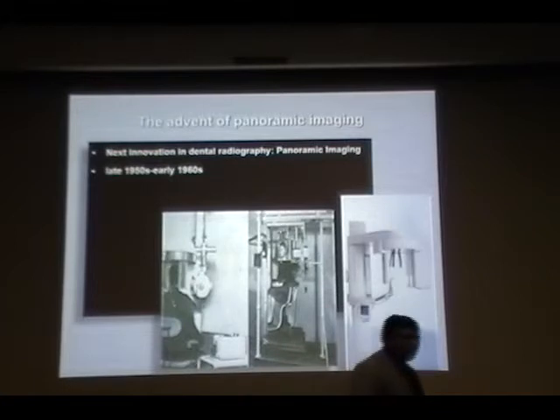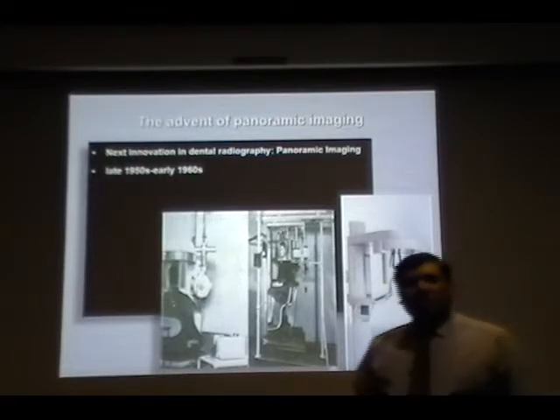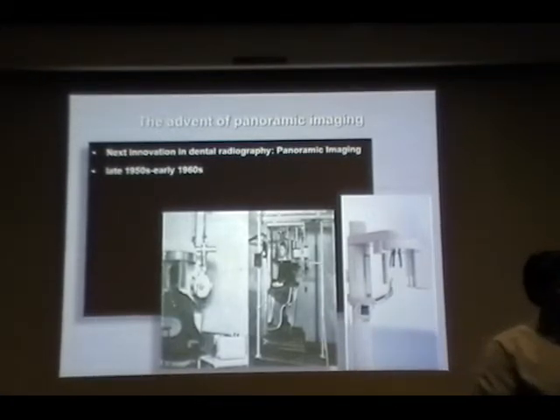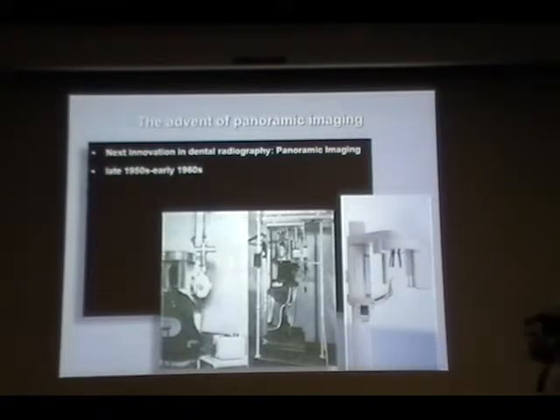So it's better to use the term panoramic radiograph, or if you find that too long, you can call it PAN, P-A-N, or PANO. And if you talk to older clinicians, they say, hey, go and get the Panorex, because they are used to that brand.